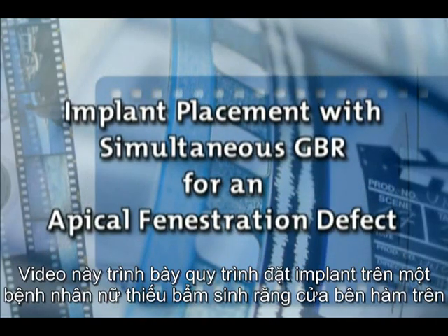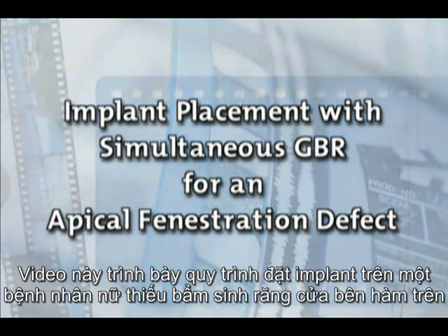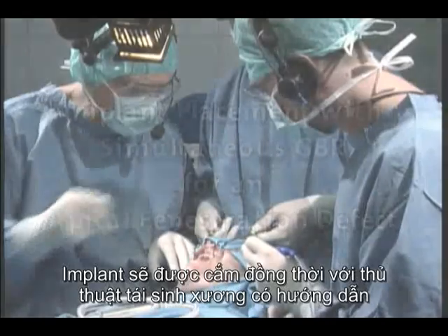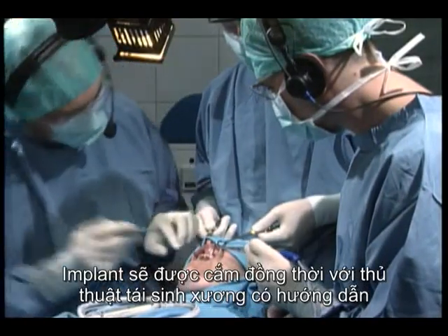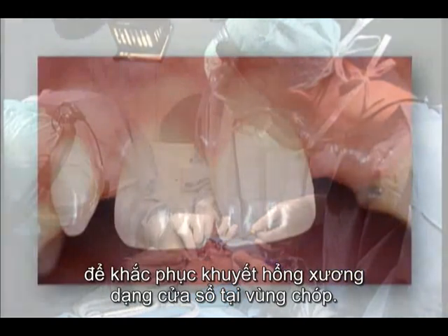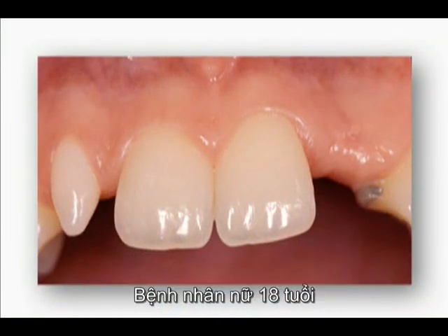This demonstration shows an implant placement in a young female patient with a congenitally missing lateral incisor of the maxilla. The implant will be inserted with a simultaneous GBR procedure to augment an apical fenestration defect. The patient is 18 years old.